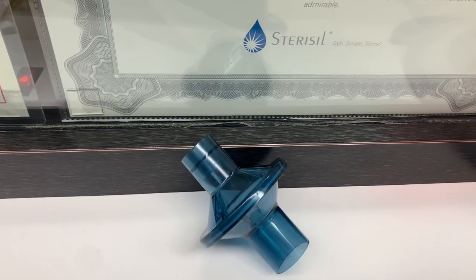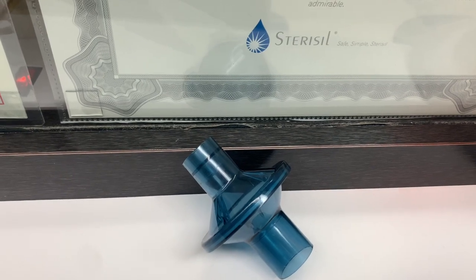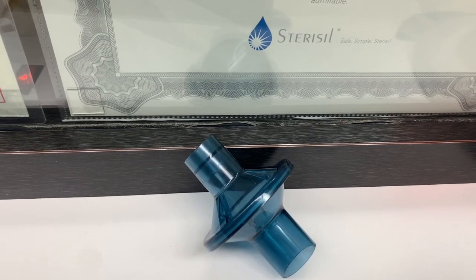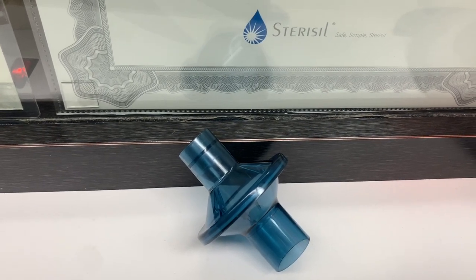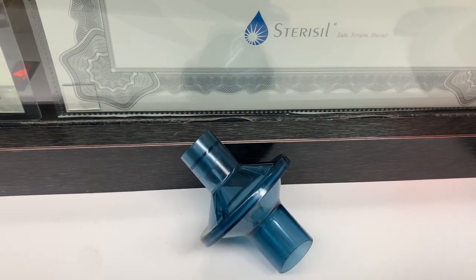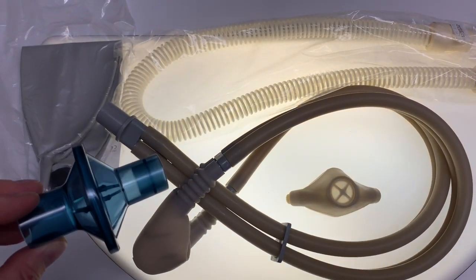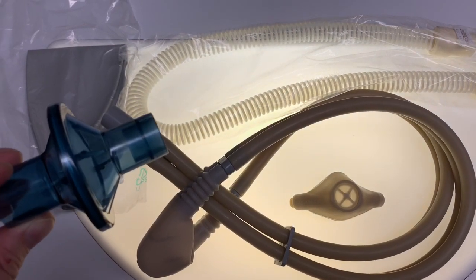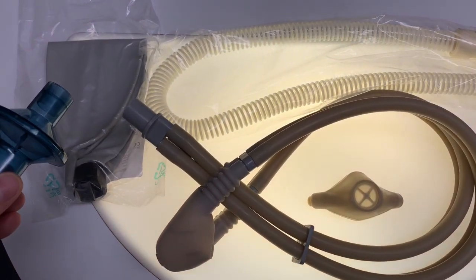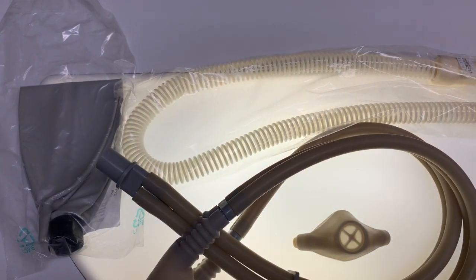These filters have two connectors. One side is a 15 millimeter / 22 millimeter inner diameter, outer diameter connector, and the other side is a 22 millimeter inner diameter connector. So these bacterial virus filters are single use, meaning that after each patient they get disposed of. The filter protects the breathing bag and the fresh air corrugated tubing from cross contamination.